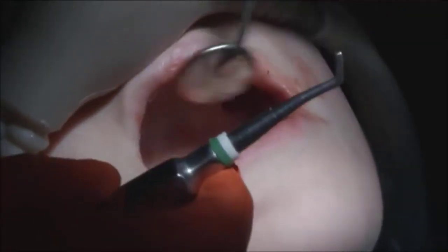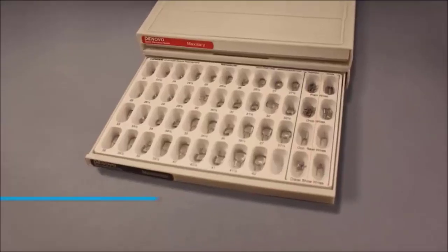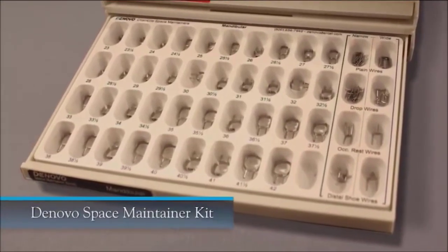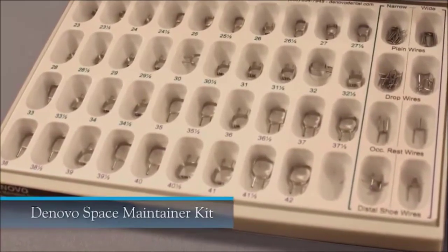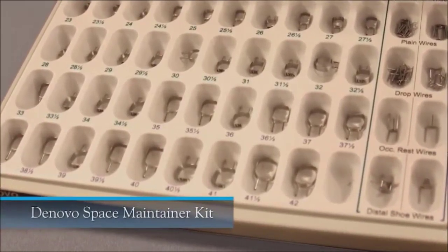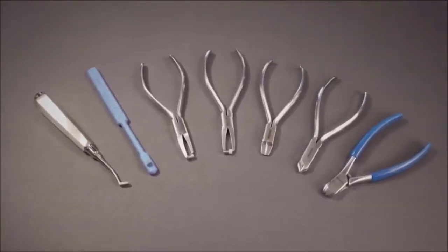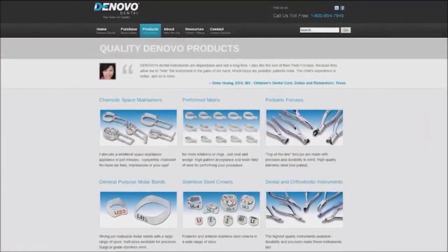The bands are easy to install — if you know how to install a GP molar band, you can install a chairside space maintainer band. All components needed to fabricate the appliance chairside are included in the De Novo space maintainer kit, except for band cement. Any glass ionomer can be used for cementing the bands. The cost savings compared to lab-fabricated devices are significant. Additional tools designed specifically to aid in quick and efficient installation are also available.